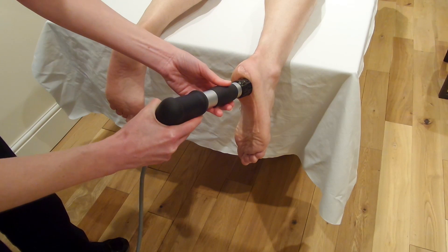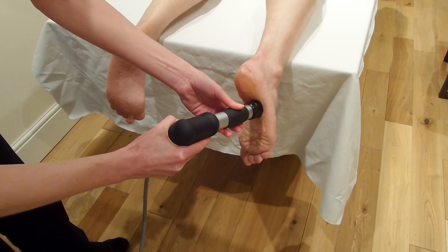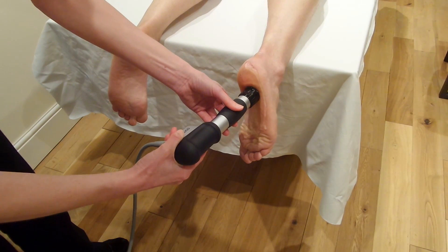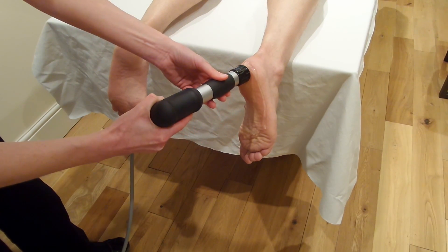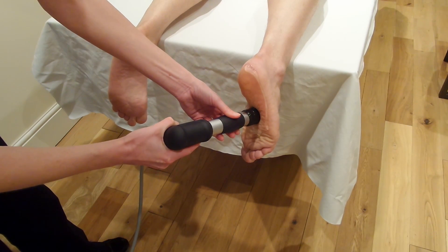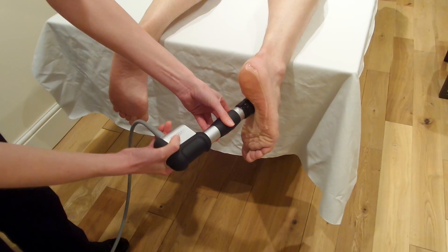Work up and down the plantar fascia generally in a snaking fashion, although you can stop and lie on spots of particular discomfort to make sure that you treat those spots more thoroughly than other parts.